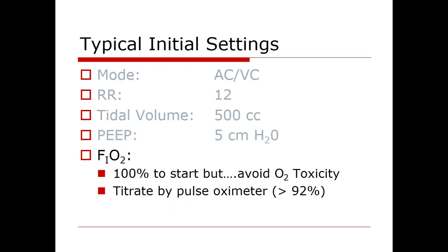And even if I took Blaine Knox sitting there, who looks pink, he's probably well saturated right now on room air, and I intubated him, right at the beginning, I would still put him on 100% FiO2, even though he probably only needs room air. I'm going to start on 100% FiO2 with the rationale being why leave a controllable variable uncontrolled during something as life-threatening as intubation.